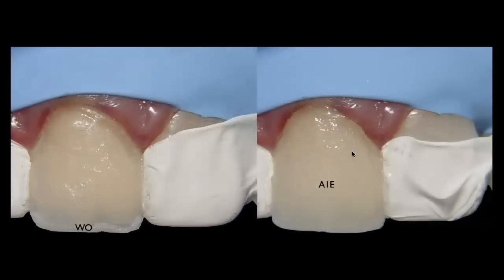And right before we place our final enamel layer, I'm going to add a little bit of the white opaque right on the incisal edge to reproduce the halo. Again, these are all features that I had identified during my color mapping exercise on tooth number 9. So all I'm doing is going by that color mapping that I achieved and making sure that I'm placing all these layers of composite based on that color mapping. So now I have the white opaque, everything is light cured, and now I'm ready for my final enamel layer.